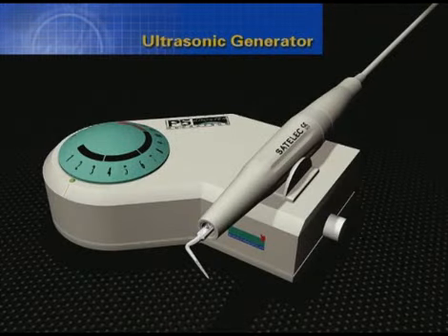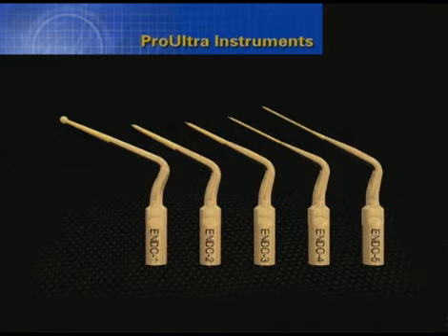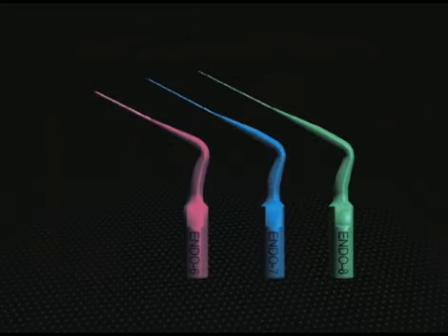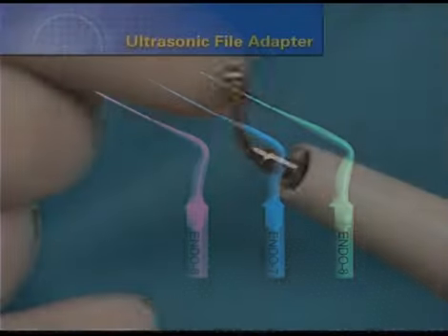Ultrasonics will be your best friend when dealing with a broken instrument. We've discussed the ability to precisely sand away dentin in a controlled manner with these instruments. You will see this advantage demonstrated in broken instrument removal exercises. Specifically, when excellent coronal and radicular access exists to an obstruction, ultrasonic trephining procedures will oftentimes loosen a broken instrument and jettison it from the canal.